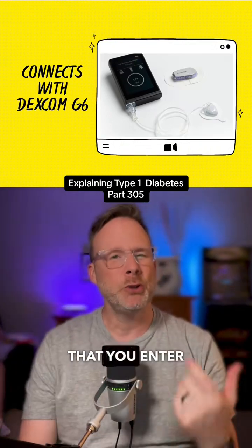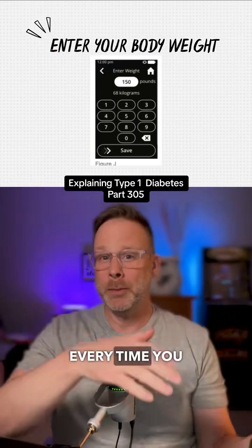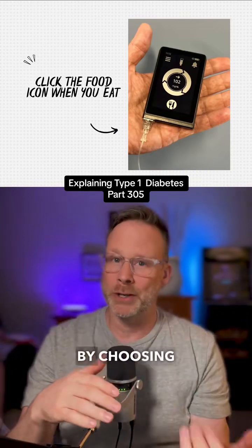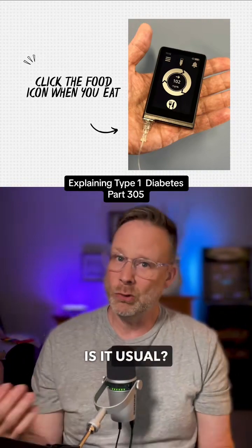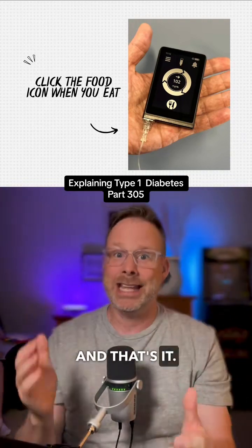It only requires that you enter your body weight, and that is almost it. Every time you eat, you click on the big fork and knife icon and you log your meal by choosing breakfast, lunch, or dinner. Then you just select how large your meal is — is it more, usual, or less than what you normally eat? And that's it.